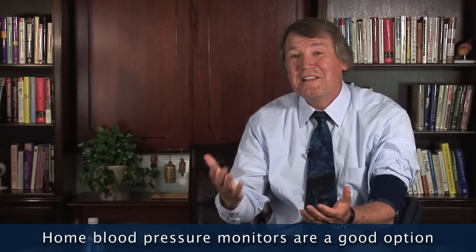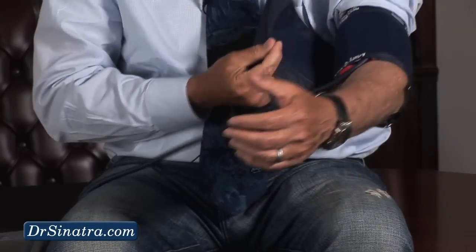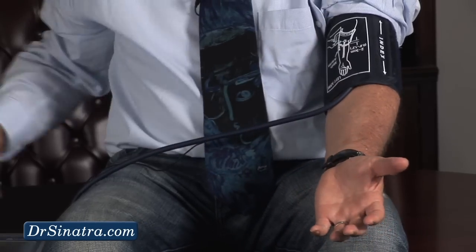You know, folks, I got lots of questions about how should I take my blood pressure? Well, this is where I really like monitors. Now, I have a monitor on, and I'm going to just hook this up and basically put it around my left arm. And remember, it's very important to follow the instructions to have the hand and the cuff over the brachial artery.